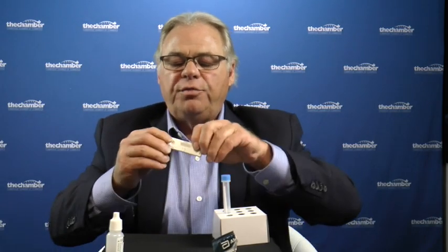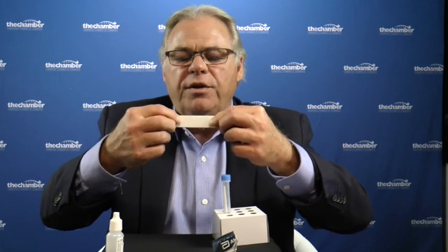What they should be doing is taking this screening pad. It has 2 spots on it. One is where the buffering agent goes in. The other one is where the result will come out. Make sure that they write their name on the back, so have a little marker ready for them. They can put their name right on the back of the pad first so that you know whose test it is. They get it ready, and you take this out, and you'll notice at the bottom of the vial, there's a little white cap. You just unscrew the white cap, and you put 5 drops into the testing area, just the little round one where you receive the buffering agent.